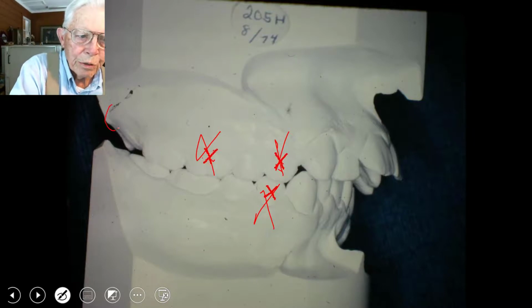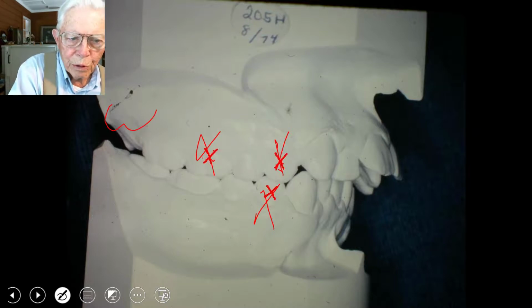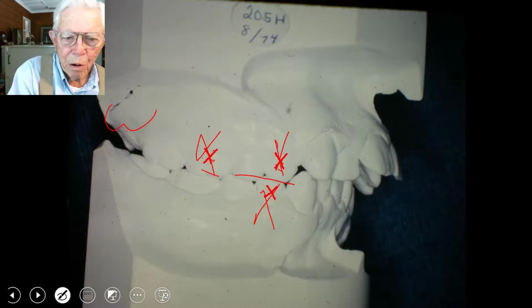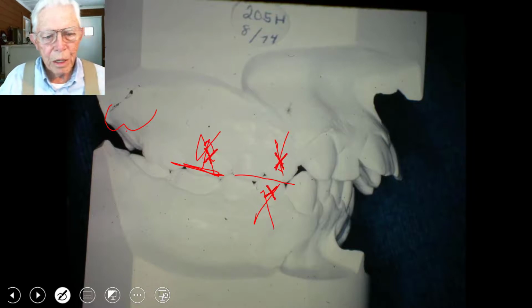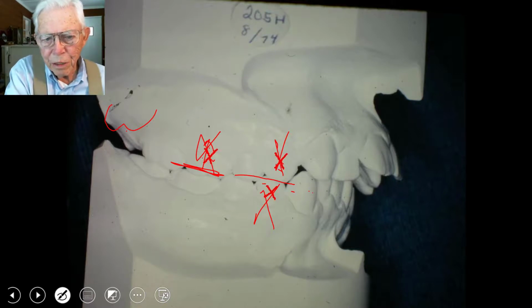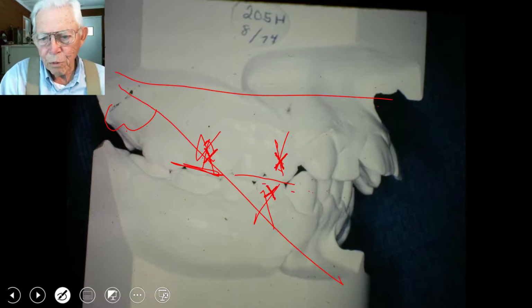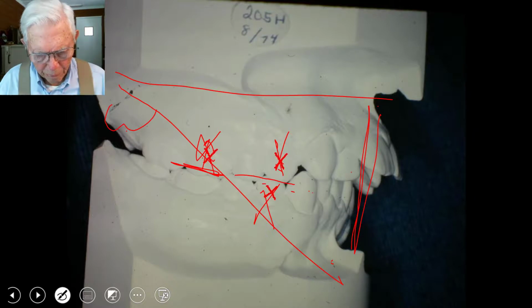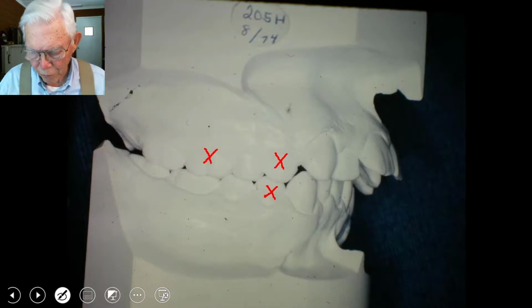Now he's got a wisdom tooth back here somewhere. It's going to come down. So we'd put all this jaw pressure in here on a molar tooth and could get it to intrude that molar. Now, as we intrude that molar and other teeth come in contact, then this angle right in coming down like this would be less. And so we could reduce this dimension in here and make it look better. Make him look better, and he could chew better too.